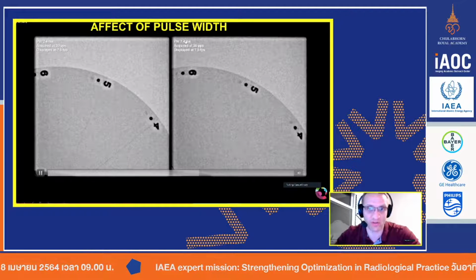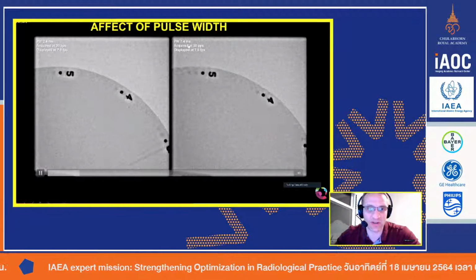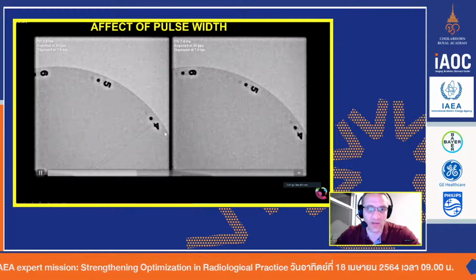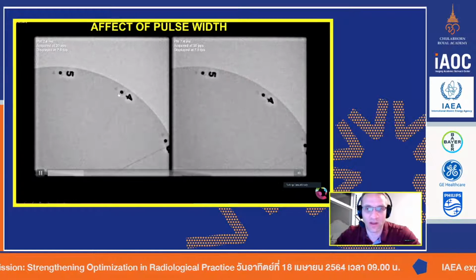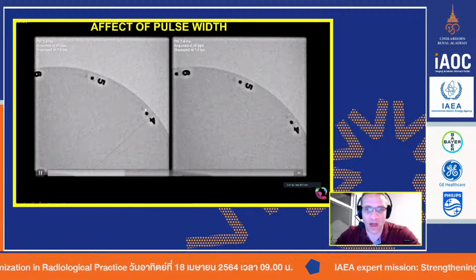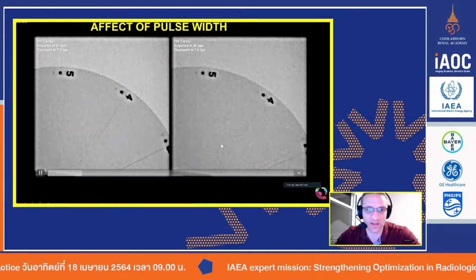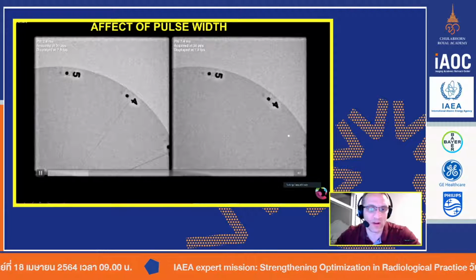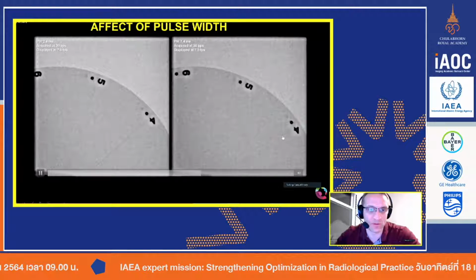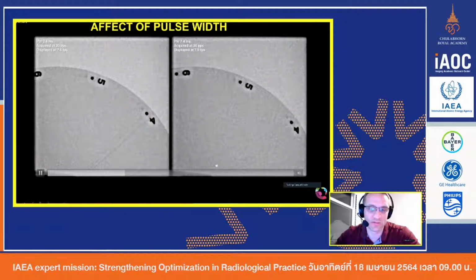So these are short pulse widths. Each one of these wires is a different French gauge, 3, 4, 5. Over here, you could probably see 3 and 4. You may be able to see the ghosting of 5, probably definitely not 6. But over here, definitely 5 is visible, at least in my eyes. And hopefully it's coming across video-wise to you.